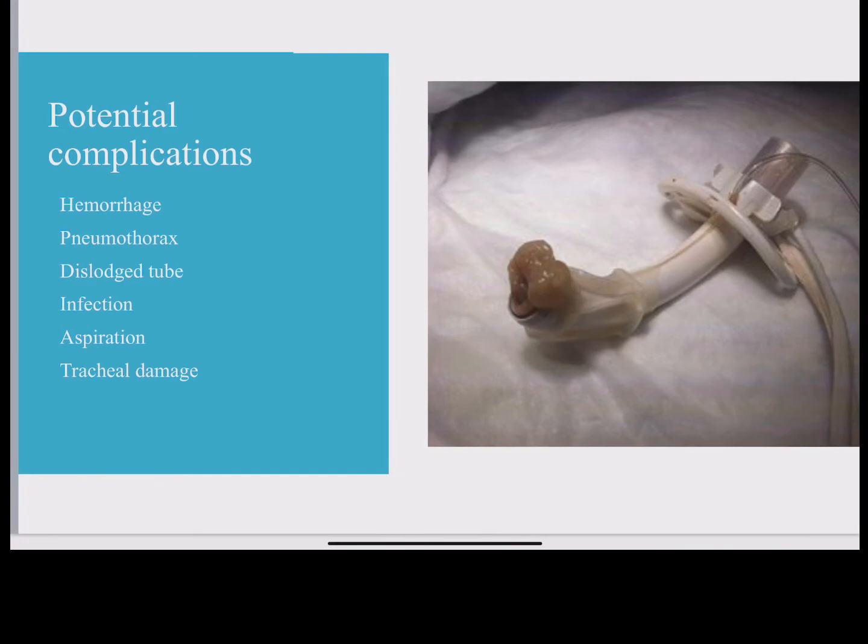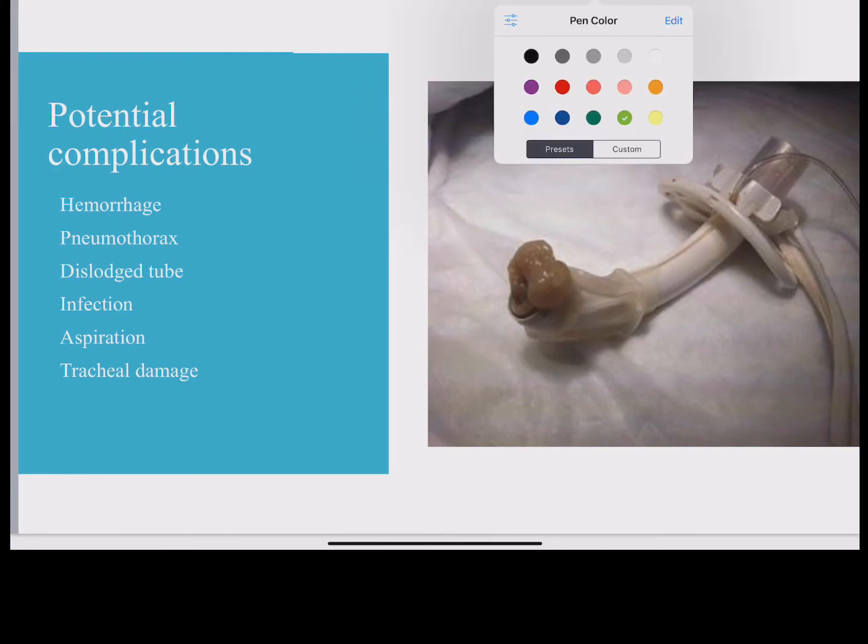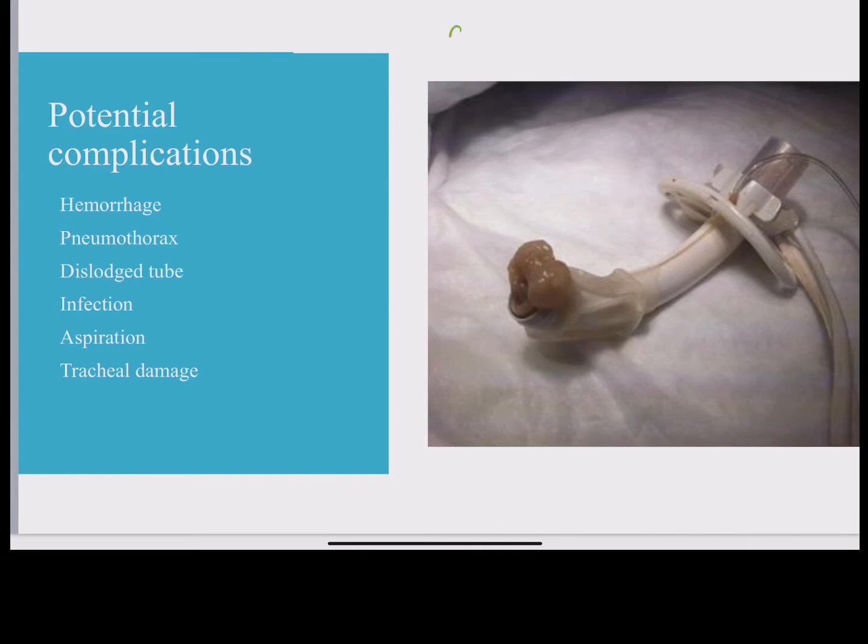However, if it's a newer trach, and especially if the patient is ventilator dependent, you're going to have to act really fast. So what happens with the dislodgement of a chronic tracheostomy? Well, if you have a trach that is older than 7 days, that is enough time for the stoma to stay open if the trach is removed.